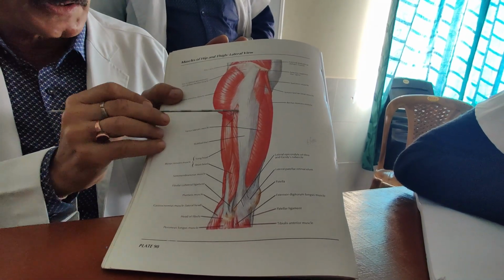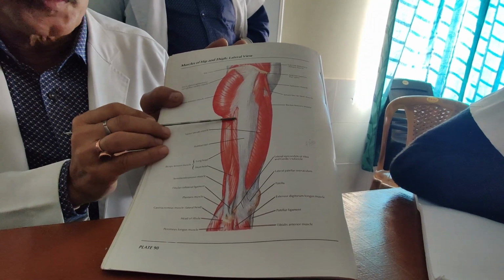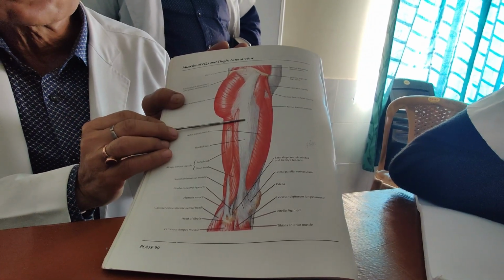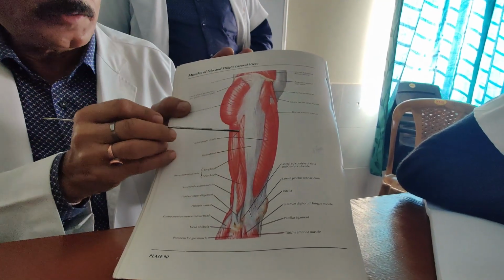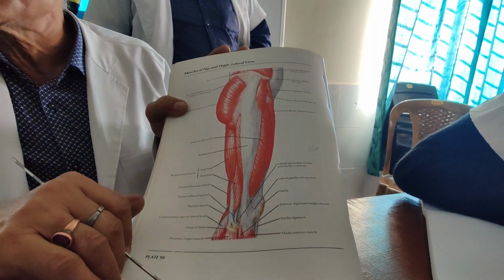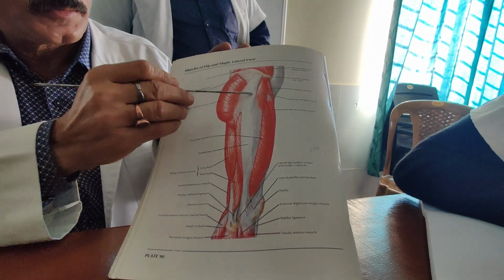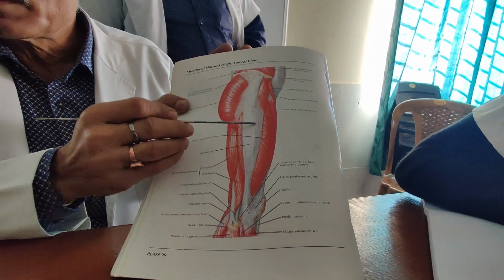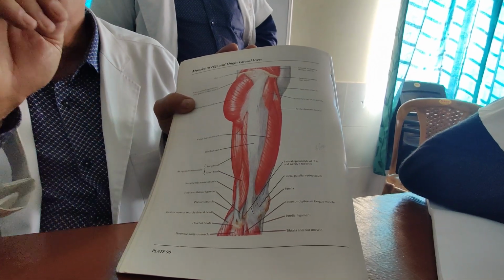Or one can do this: at the vastus posterior end, you can put a lever over there and reflect it. While reflecting, you necessarily detach the origin of the vastus lateralis. So: incision, tensor fascia lata, vastus lateralis, two techniques.